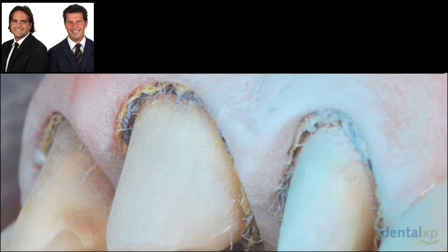So again, we arrive now at the day of the final impression. Again, we take traditional impression, digital impression, and right now I want to focus your attention on the digital impression. You see that in this picture we already placed two cords, and you're going to see in detail in the video that I'm going to show you in 2 minutes why and how we place the cords.